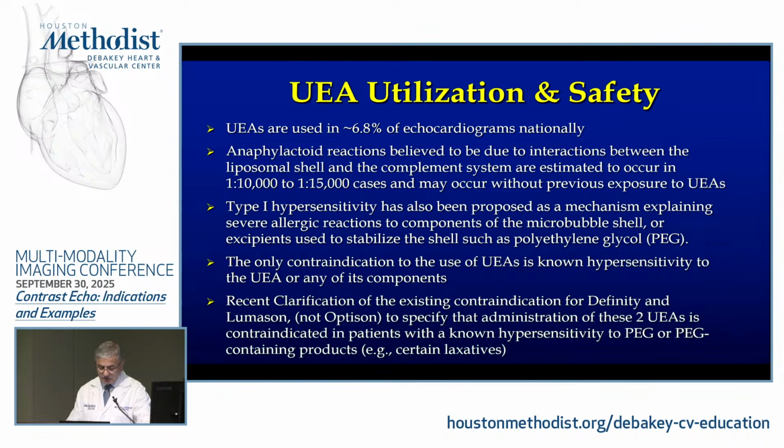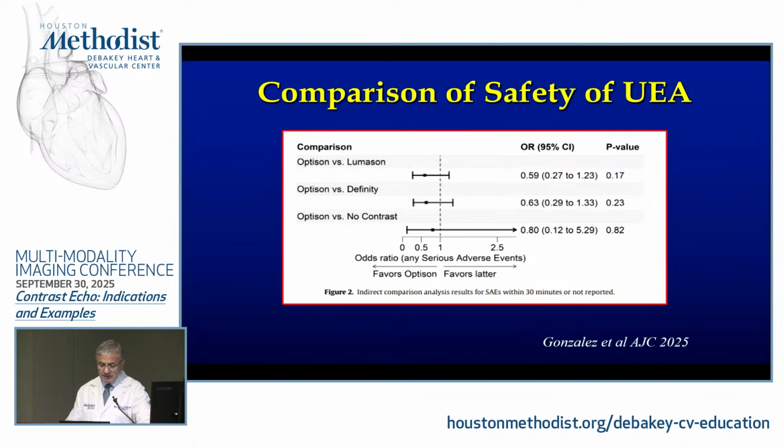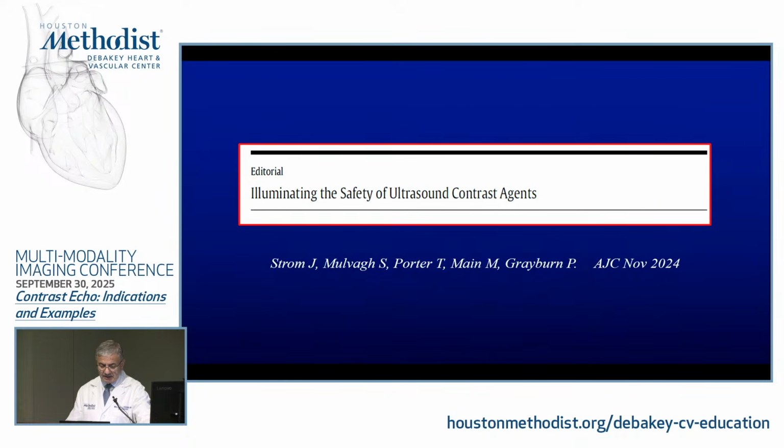Recent clarifications, not opting to specify administration of these two agents. They are contraindicated with hypersensitivity because they have the PEG containing products, right? And this is the large study from just early on this year about many patients. Bottom line is, these are safe. For the two agents who may have a little higher hypersensitivity reaction, you have to be very careful about that, and keep that in mind. And these are the forest plots for Optison versus Lumason, Optison versus no contrast, serious side effects.